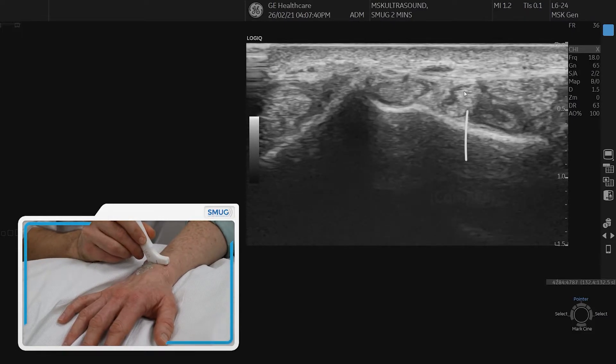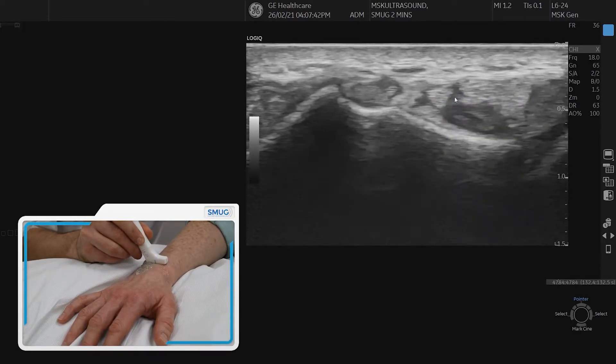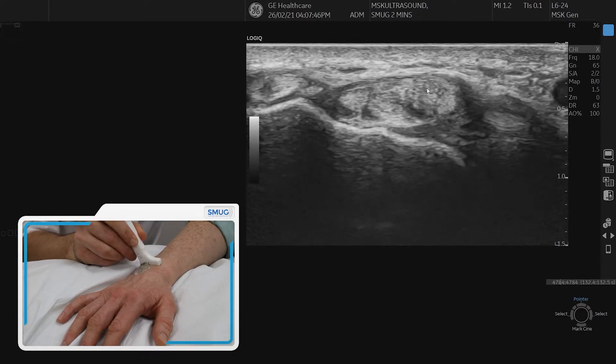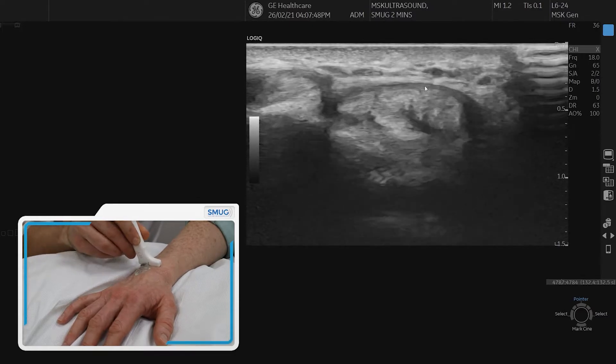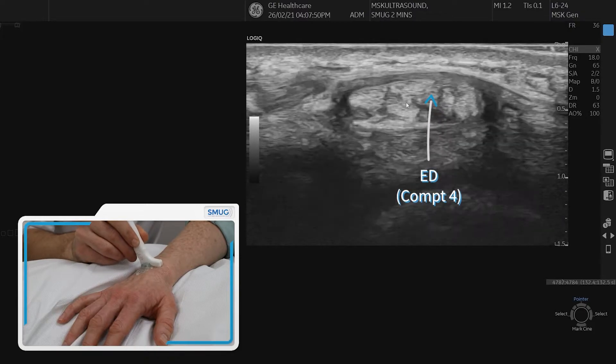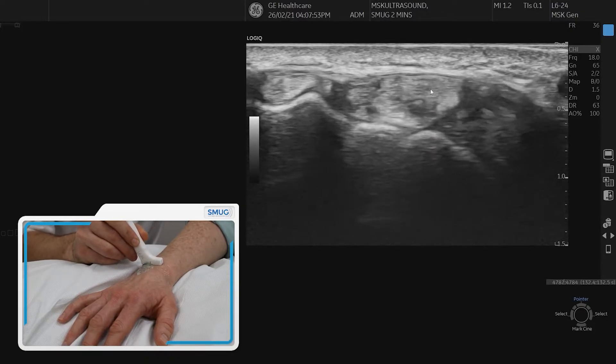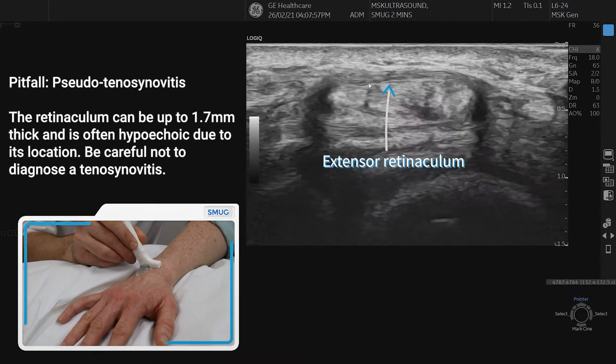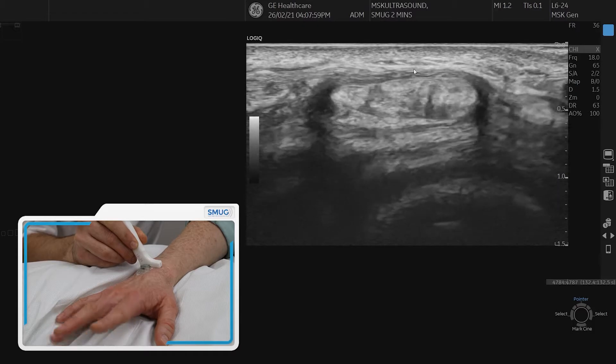If we keep going, the next tendon is extensor indicis in compartment four, and also in extensor compartment four we've got extensor digitorum. On top of the radius you can see a nice thick retinaculum, which is normal, and you can see the tendons move as your patient wiggles their fingers.